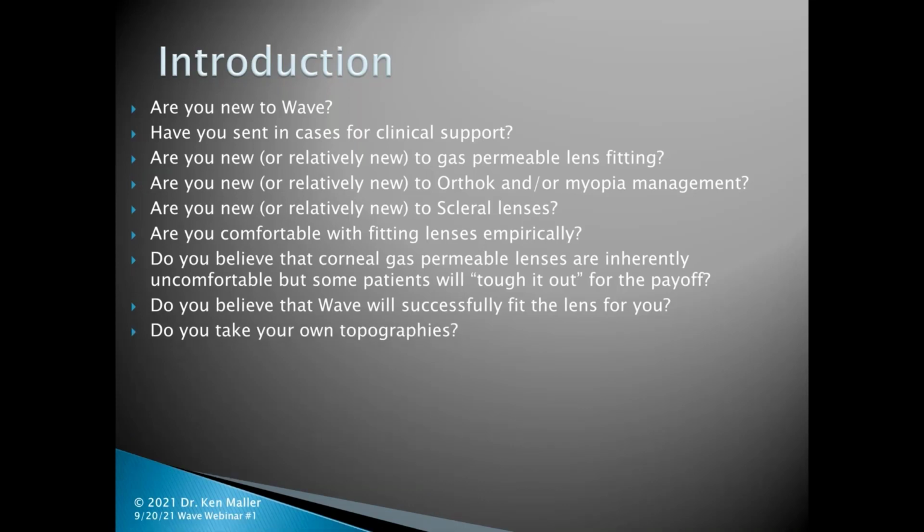Do you take your own topographies? This is an incredibly crucial question for you to answer. The majority of doctors delegate out topographies to staff, and this can be the first source of why things don't work properly for you. I take my own topographies, so I know that they're trustworthy, and you will see tonight why that is important to have trustworthy topographies.